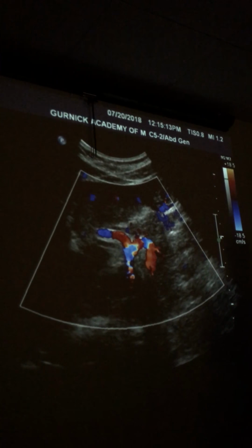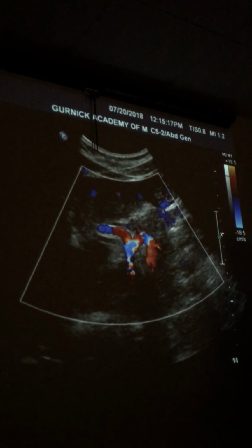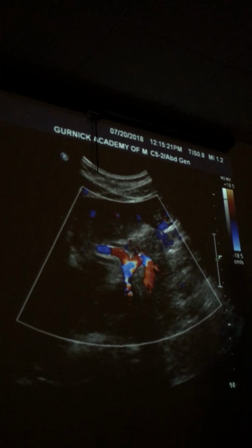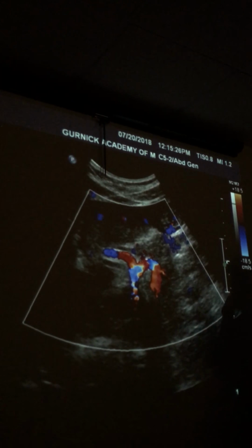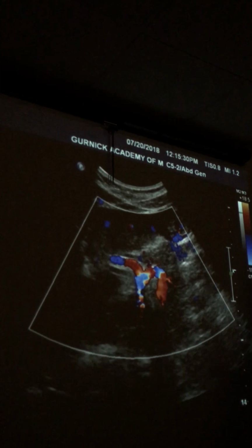Right? So when you get it, don't stop. Try to make it better. And I'm always telling you, try to make it better. Stephanie's always telling you, try to make it better. That's what we're talking about. You scooped under for that? I did. I scooped under, but I remember you got 360 degrees of opportunities there. For her, the under scoop was better.